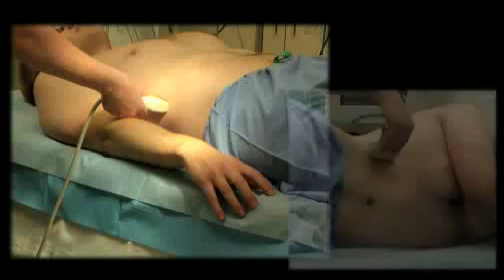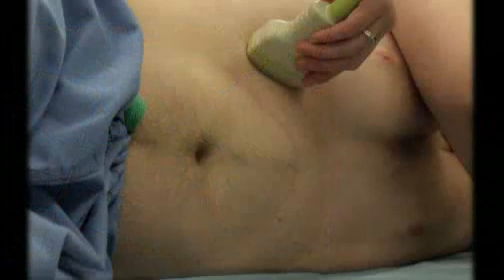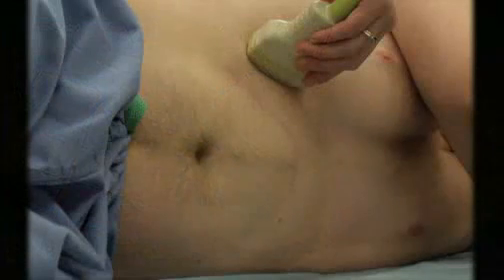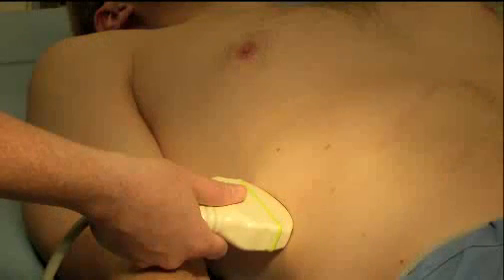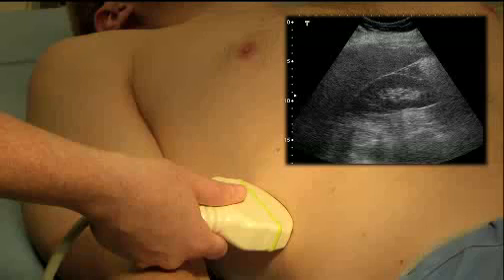The patient should be positioned supine or in the left lateral decubitus position. If unable to get a good view in one position, try the other. Use the abdominal probe or curvilinear probe in a longitudinal position either at the right upper quadrant or starting in Morrison's view, also known as the hepatorenal view from the FAST exam, with the marker aimed cephalad. Starting at Morrison's view may help orient you to surrounding structures and help lead you to the gallbladder. Having the patient inhale deeply may bring the gallbladder into view as the diaphragm depresses the liver.